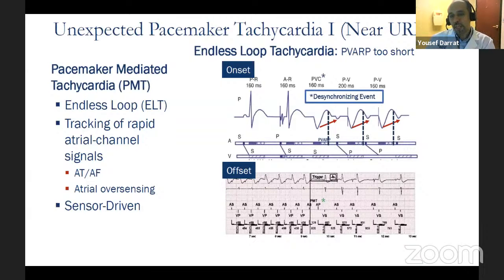You put in a pacemaker and then bring him back and reimplant an ICD? Every time we open the pocket, there's an increased risk of infection, and more expense. Why would you do that? So that's a point. Anyway, I'm sure there's going to be a debate with a lot of options, but this is a good paper as a reference.